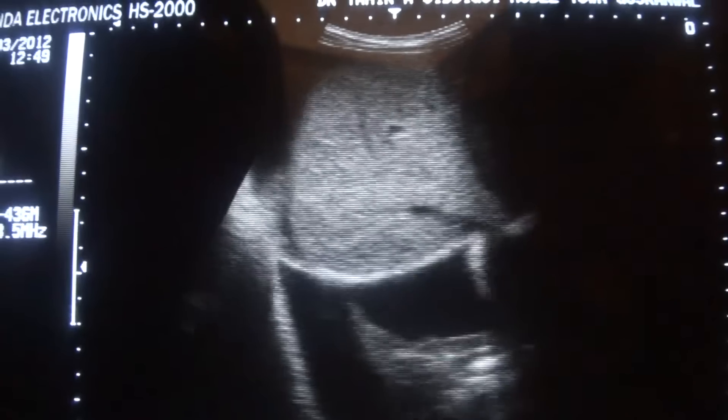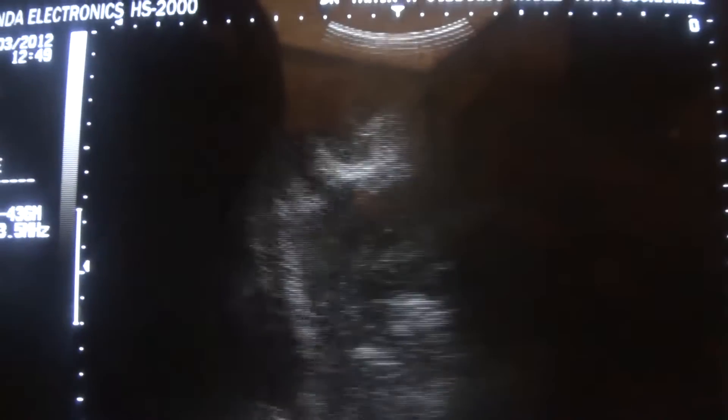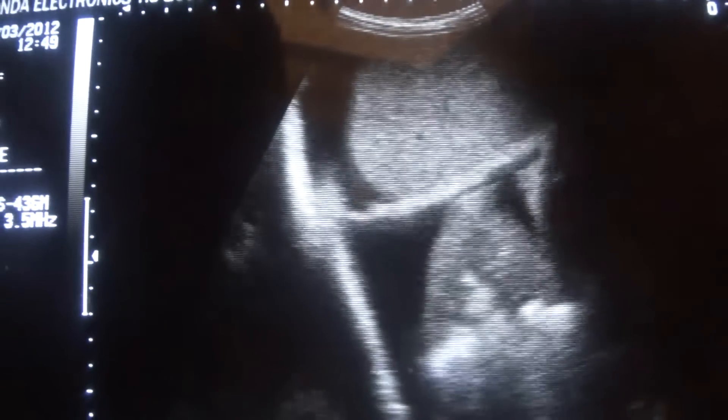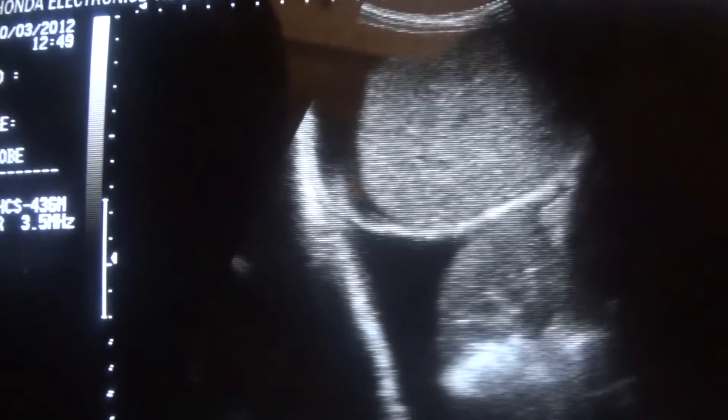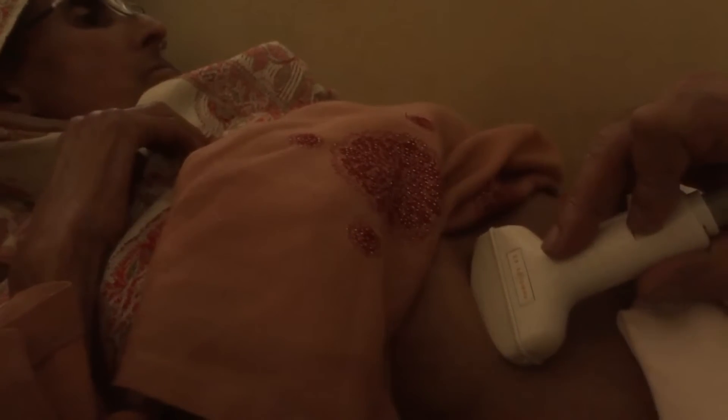Subconsciously look at my scanning angle. I am scanning from the mid subcostal region, angling the probe towards the patient's umbilical area, and I see this picture.